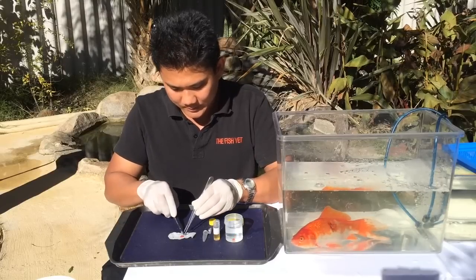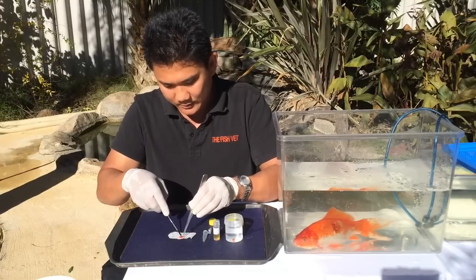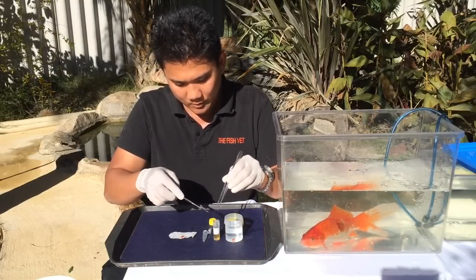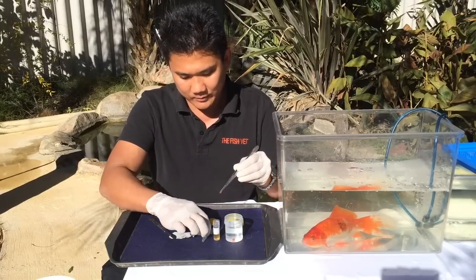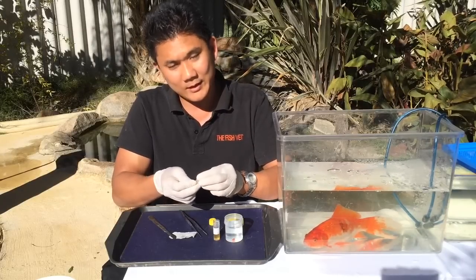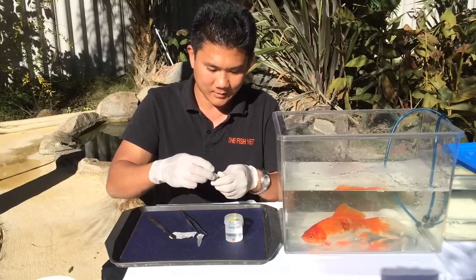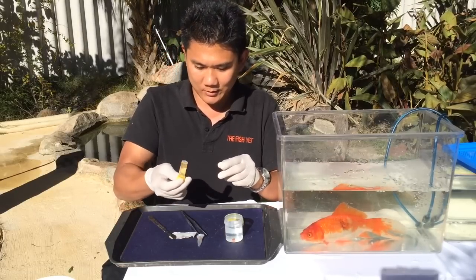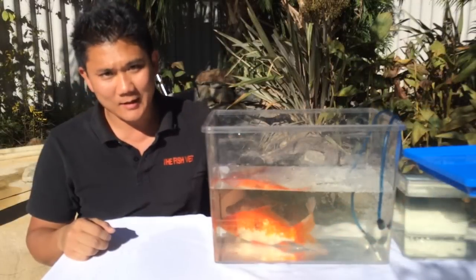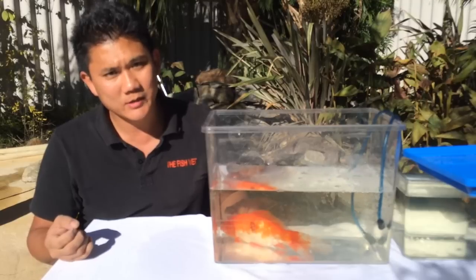We've got a fairly small lump so we want to divide it up evenly. For histology, basically just slice the tissue and put it in there to preserve in formalin. For the virus transport media, another small slice would be sufficient. You can also take a swab and put it in there. For the Eppendorf tube, there's no preservative — just keep it frozen, send it to the laboratory, and they can store it at minus 80 degrees Celsius. Make sure your lump gets inside the fixative.